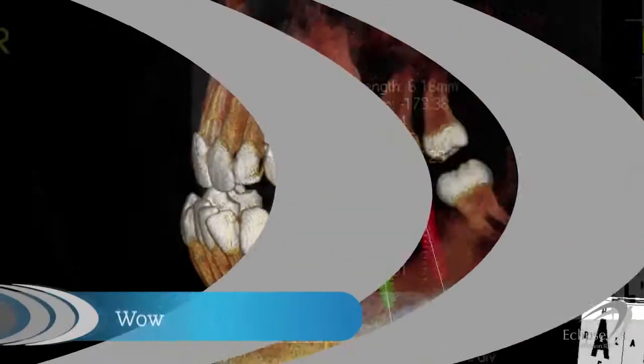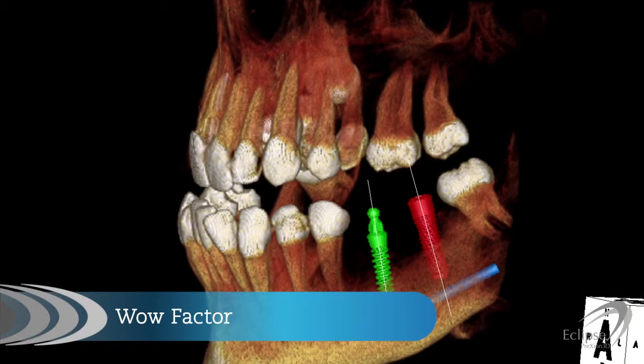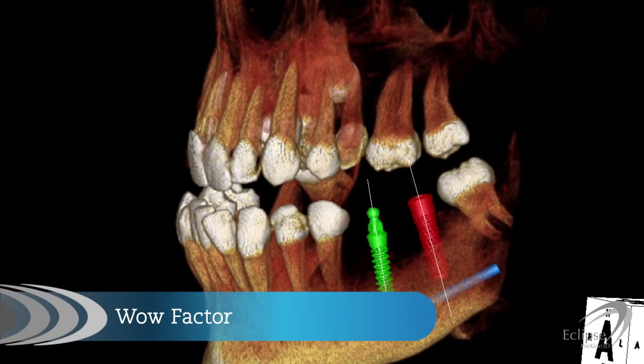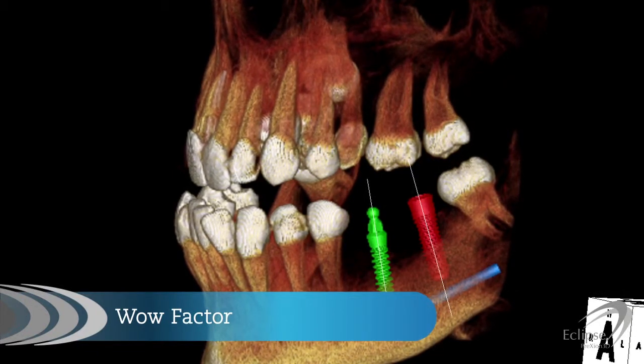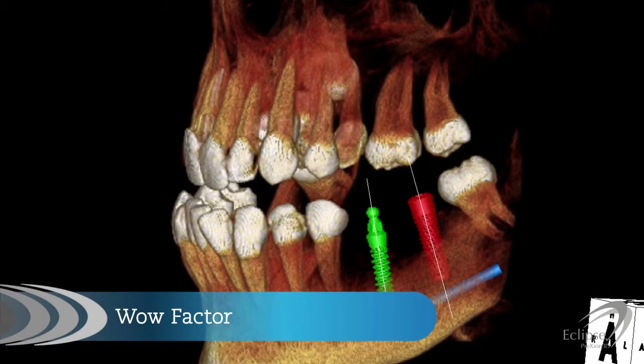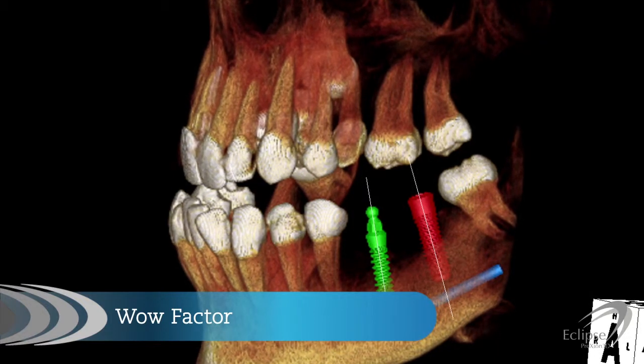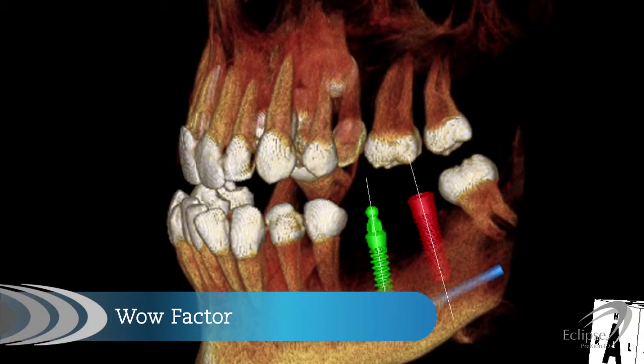Your patients are sure to be impressed as the Prexion 3D Viewer software truly delivers that wow factor. With it, you can offer them the following.